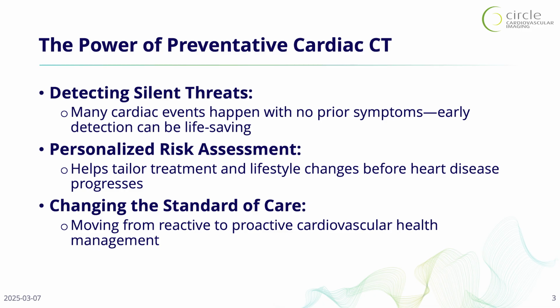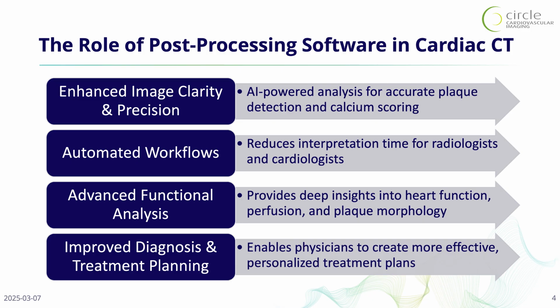And we get into this personalized risk assessment, not just within cardiac CTA, but also within the vendors and the applications. And that's changing the standard of care, moving from a reactive to a proactive cardiovascular health management. The role of post-processing cardiac software is enhanced image clarity and precision, and this AI-powered analysis for accurate plaque detection and calcium scoring, and automated workflows, like you saw, where normally a whole 3D lab would have to post-process that.